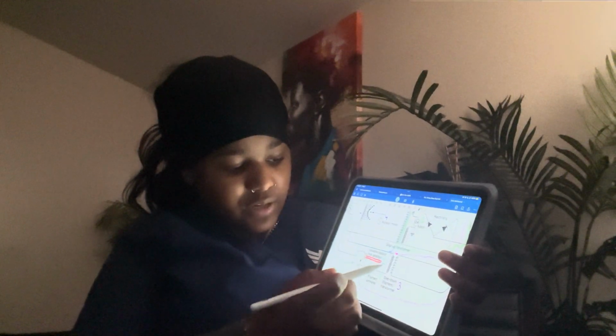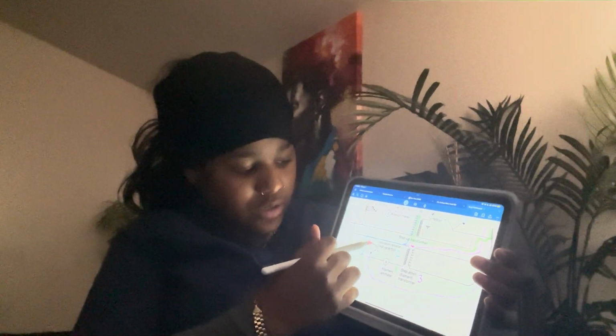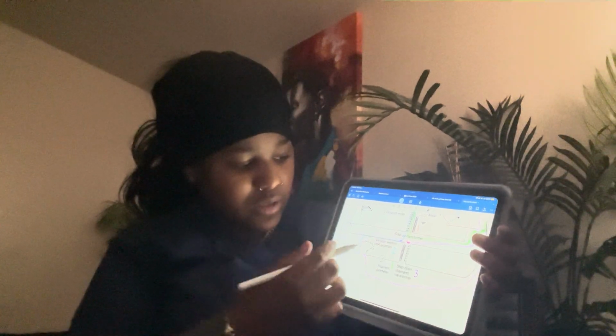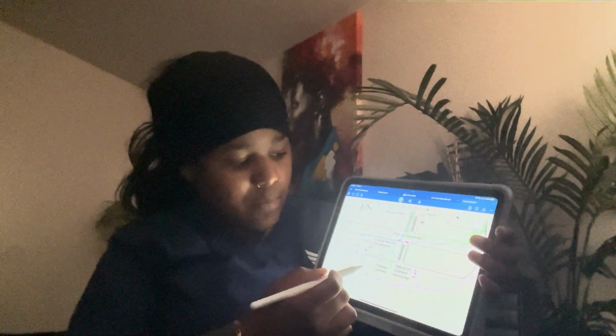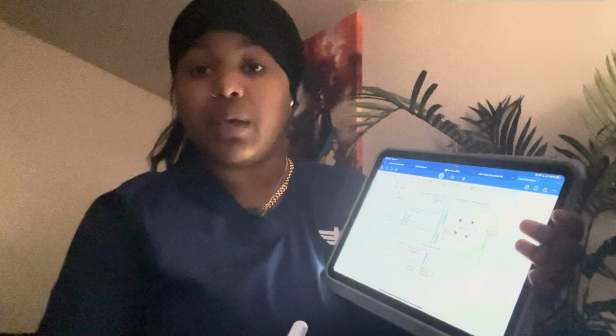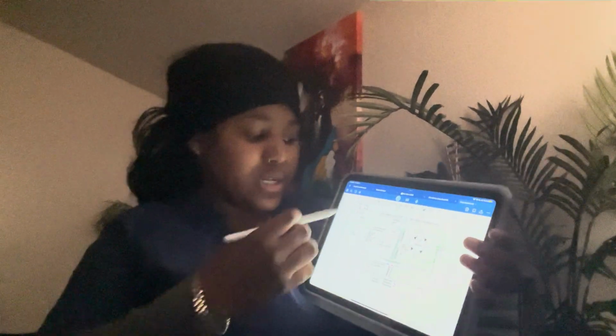So we have the mA selector after the filament. This is a variable resistor, and a resistor is what resists current. When the variable resistor is used, this is what allows the mA setting for the X-ray circuit to produce an image. This allows us to control how much milliampere is going to be included to produce an image.